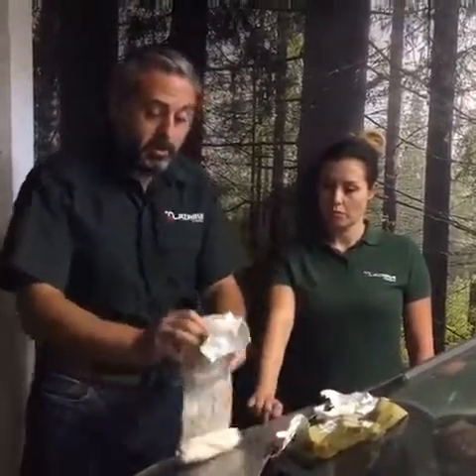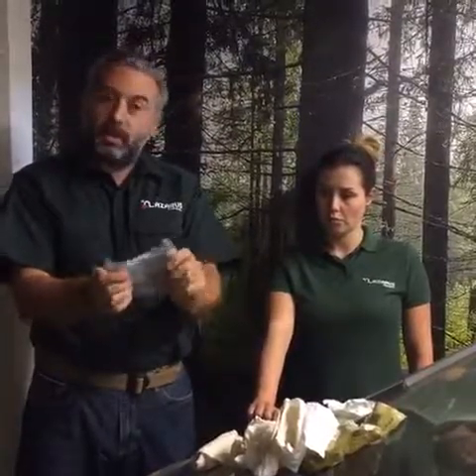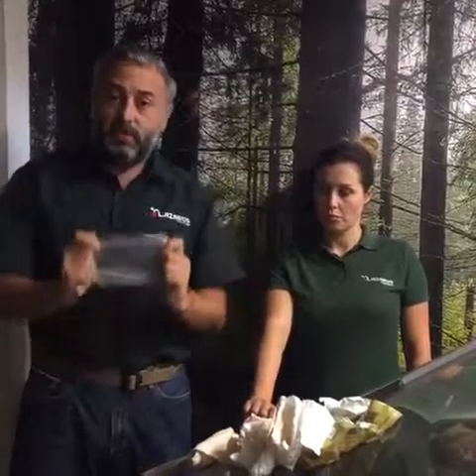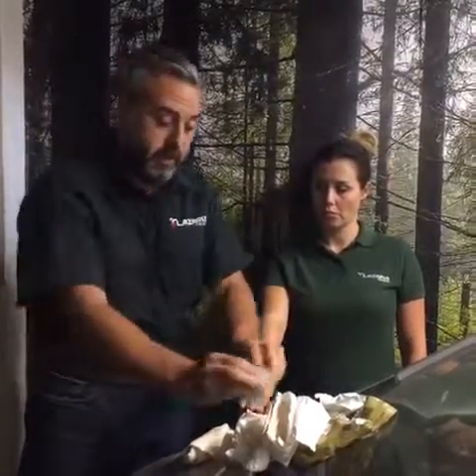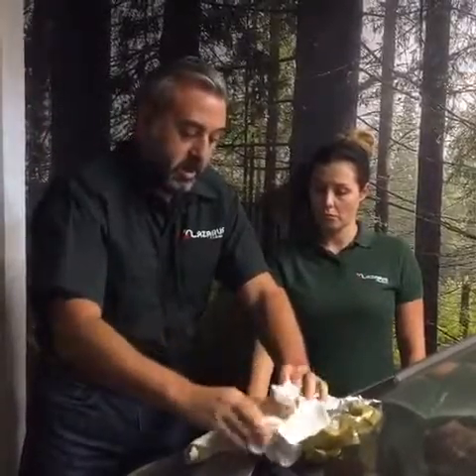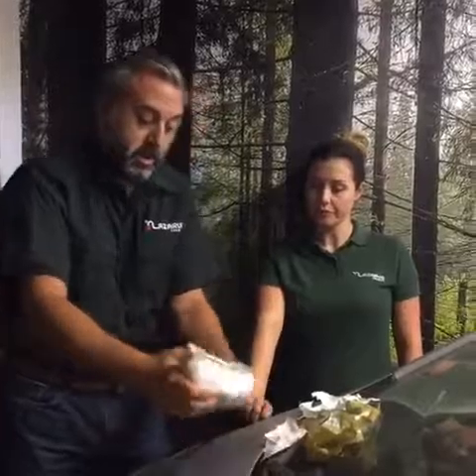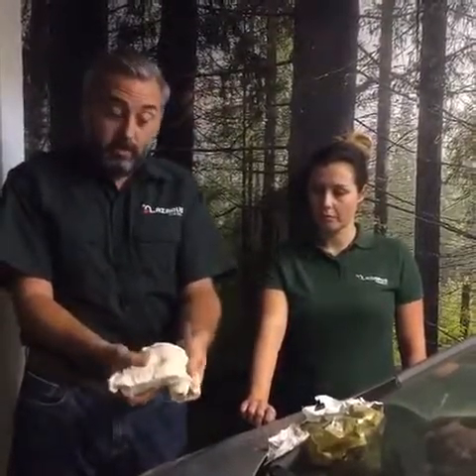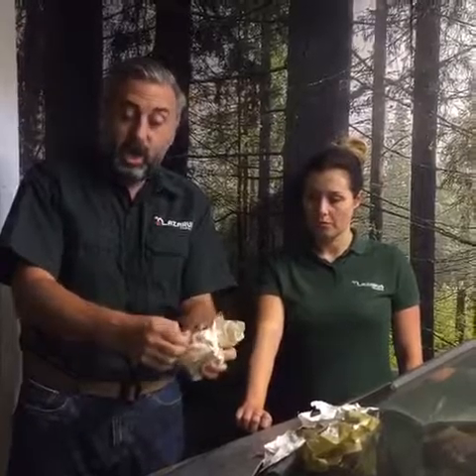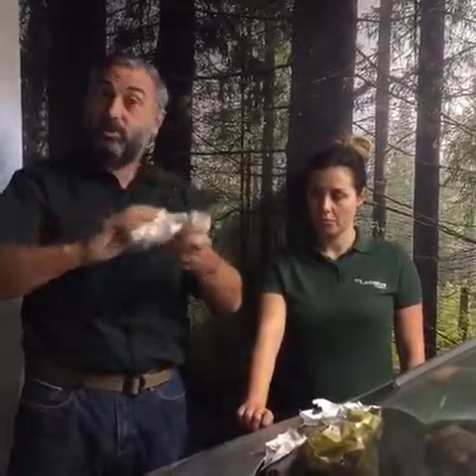Hidden away in the compartment is one other little bit as well — there's a small sheet of plastic. Those of you who have done our more trauma-based courses will know there are all sorts of different uses for the plastic in the back of this pad. And there is one final feature: our aiming mark that I started with is actually designed so you can break it off, and this cup can be used as a protective area to cover an eye injury, perhaps with a pad going over the top to hold it in place.